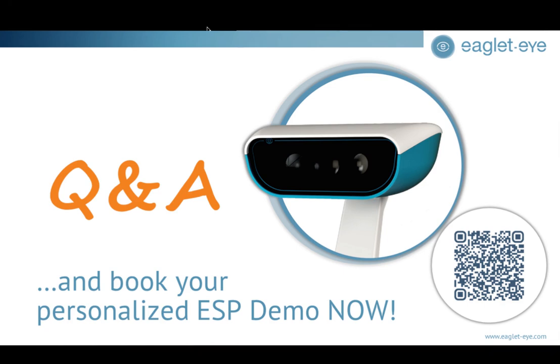Yeah, we still do it the same almost every single time because it's really not hard to do. To be honest, with OrthoK or if we're, for example, fitting a corneal GP, any scan that we do, we attempt to move the lids out of the way to the best of our ability. It should never be painful. It should never be pulling. But it is true that you do not need to have the lids open all the way to the sclera for OrthoK, so it makes it just a little bit easier.